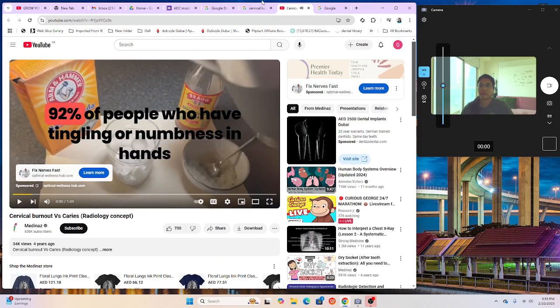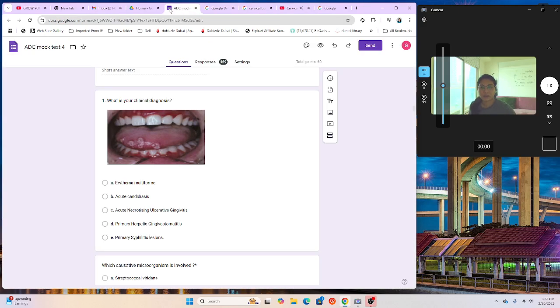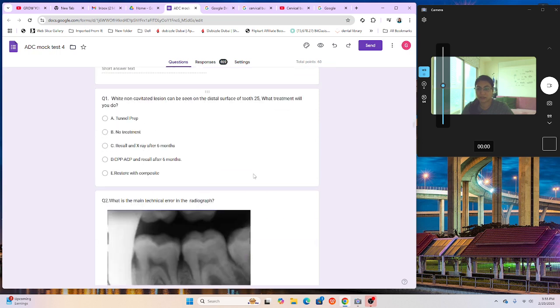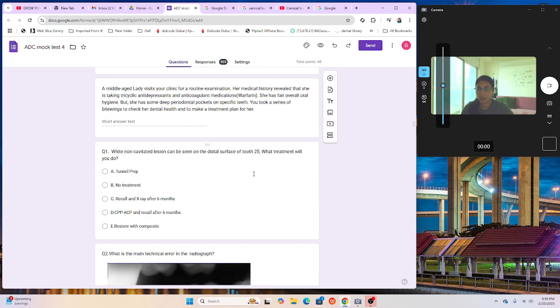So yes, now you understood what a cervical caries looks like, right? I wanted you all to see this video because our question is going to have that. Today we are solving another question of the Australian Dental Council exam, and it's again a good question which will be asked in a different format in your own exam. But yes, one question on this topic will definitely be asked, and that is radiological errors.